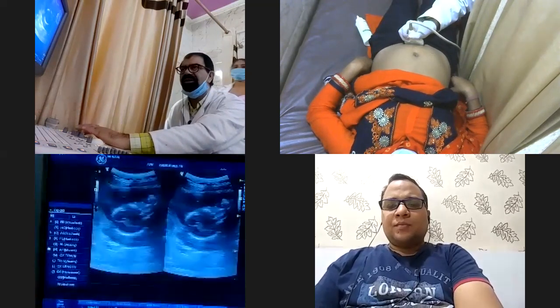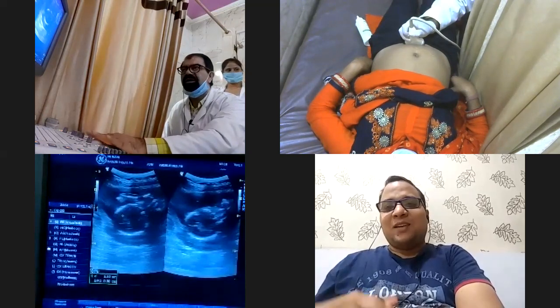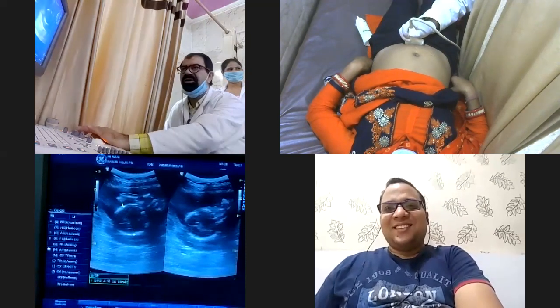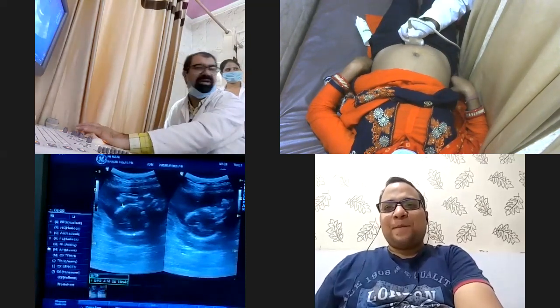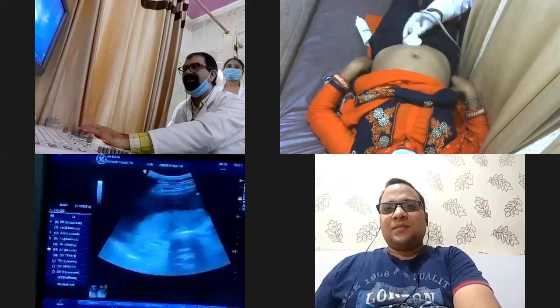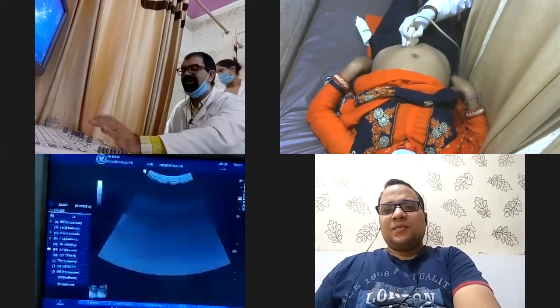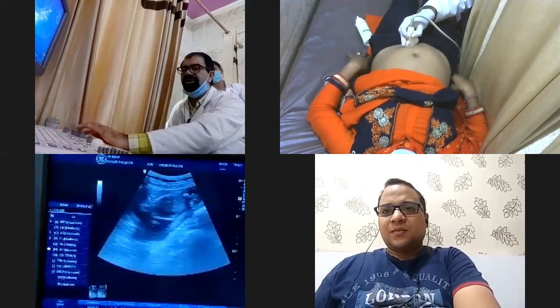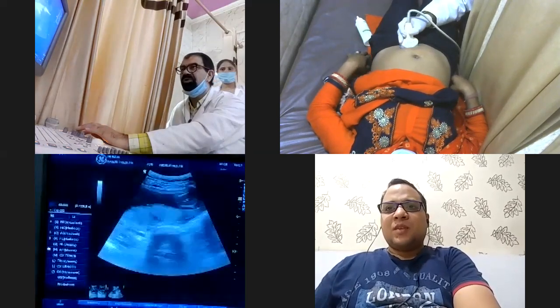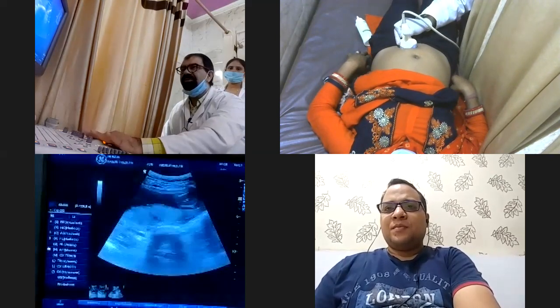So are you doing fetal ultrasound also? No, sir, I'm very new to ultrasound. I'm just starting ultrasound after this. Planning to start. So those who are already doing ultrasound can see that there is a fetal head over there. We are not discussing fetal ultrasound over here, but my point for now is to make you understand the longitudinal and the transverse section and the rotation of the probe. Now I am seeing a placenta over here.